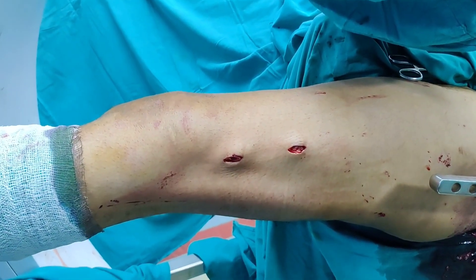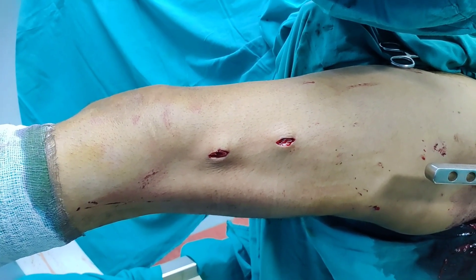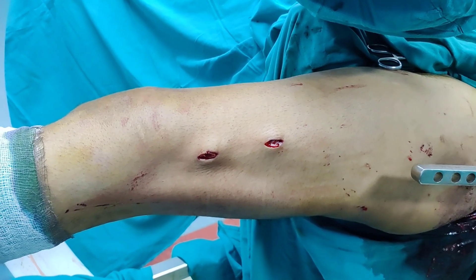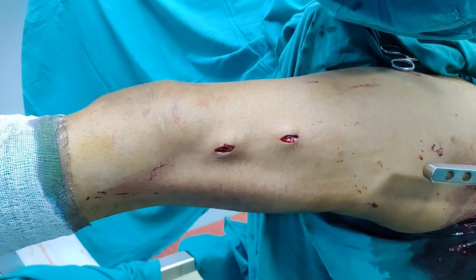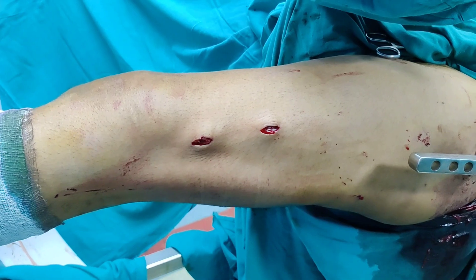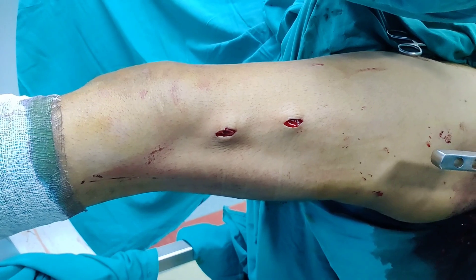These are the two small stab holes that we have made, and these are of the same size as what we use for distal locking. You have not opened it up and you have got all the advantages of doing it closed because you have not really disturbed the fracture site or fracture hematoma. This is a very useful trick — making two small holes, neutralizing the forces — and you will struggle less and get a good reduction and a good post-op x-ray.